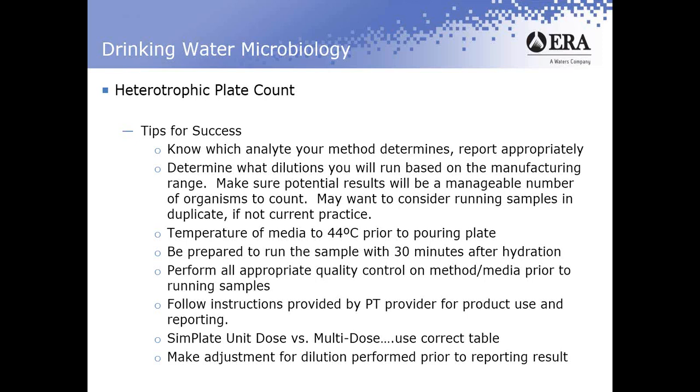Follow the instructions that are provided by the PT provider, again, for the use of the product and the reporting. Again, instructions may vary from provider to provider. We may change our instructions at some point along the line. Don't assume that there were no changes from the previous study. If anything changes, we'll try to call it out for you, but you should always be reading those instructions, even if you've done these studies dozens of times. You just want to make sure that nothing has changed. It's just a horrible way to get a failure.